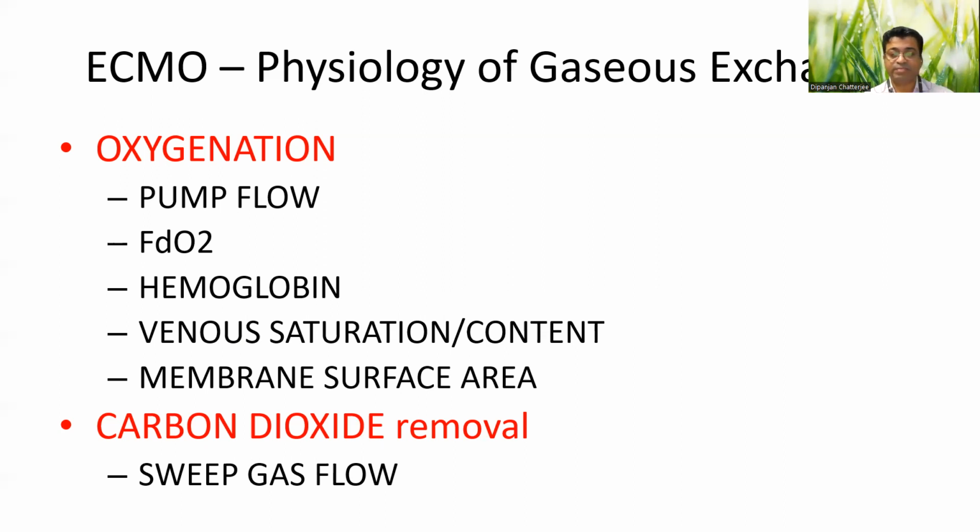As we increase the membrane surface area, there is more contact between blood and the gas interface, and more gaseous exchange occurs. Compare it with the carbon dioxide removal. It is solely dependent on the sweep gas flow.